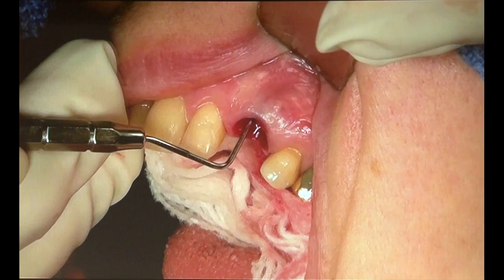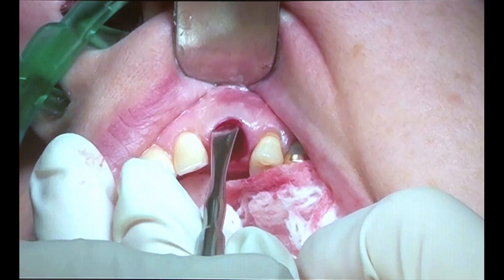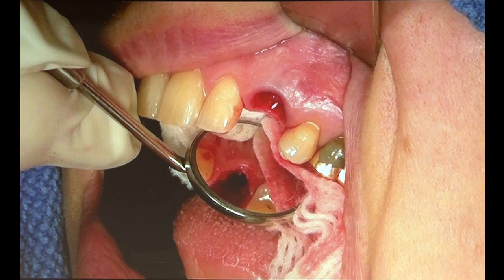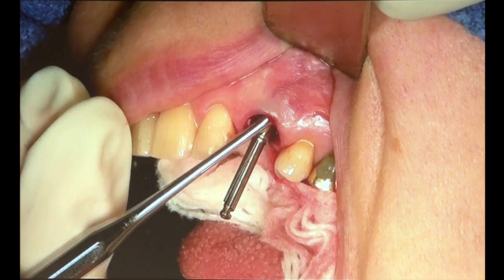Here I'm just measuring the defect and proceeding to add augmentation material, specifically out to the labial. This is an alloplast material. Any of the alloplastic graft materials will do. Once I have grafted the labial, I'll take the twist drill and place it back into the site so that when I'm further grafting along the cervical margin, I don't push this material down into the prepared site.